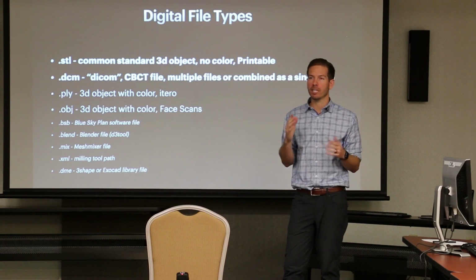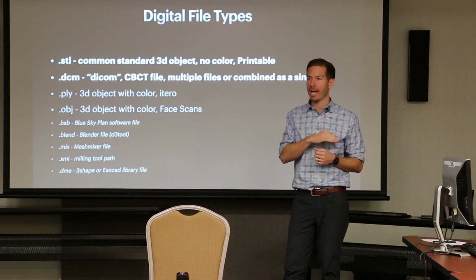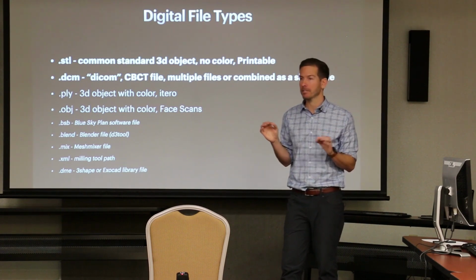So when you guys get your cone beams, I don't know which ones you're getting. It might be a little different than what we have, but when you learn how to export DICOMs, just make sure you export it as a single file for the patients.